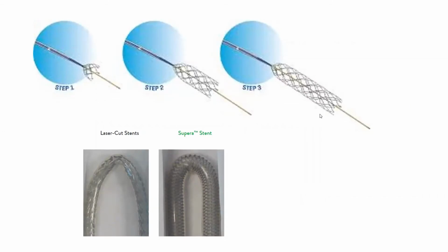So what is a self-expanding stent? A self-expanding stent is a stent made of nitinol, which is a material resistant to deformation and tends to retain its shape. It's also resistant to kink. The stent is collapsed, tucked inside a 0.035-inch catheter, but it keeps the memory of its expanded form. So you advance it into the vessel, then you unsheath it. It has a screw mechanism that allows you to unsheath it. And as you unsheath that catheter that's over it, the stent expands and takes its form.